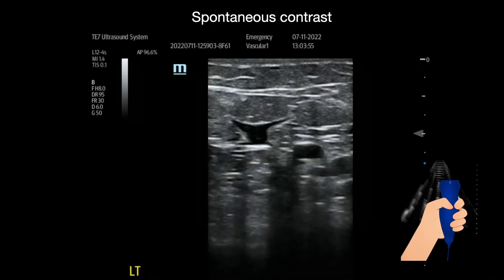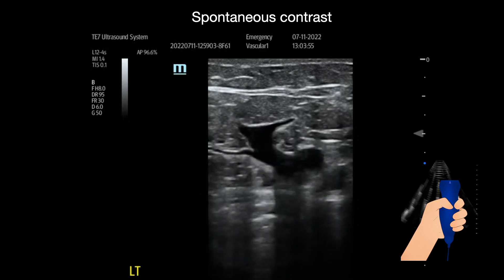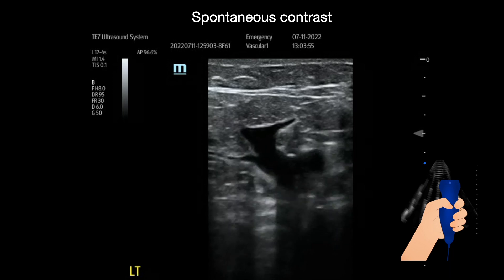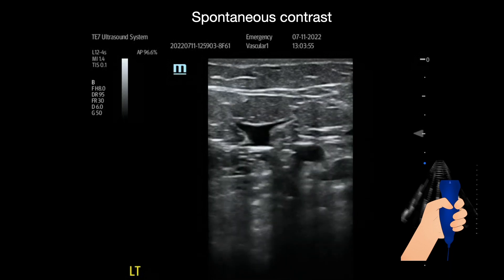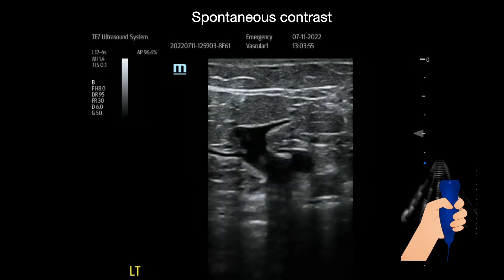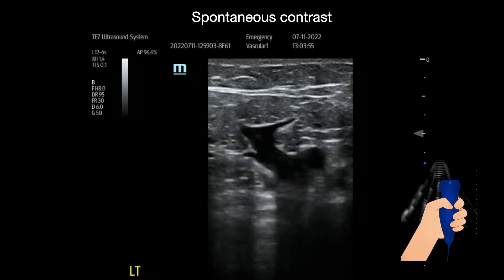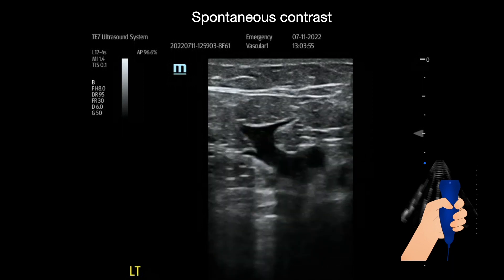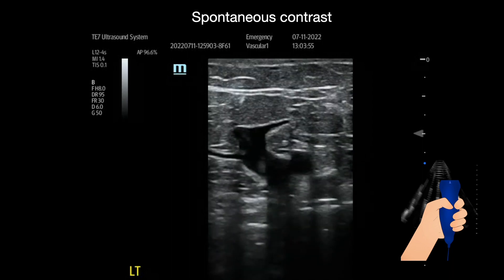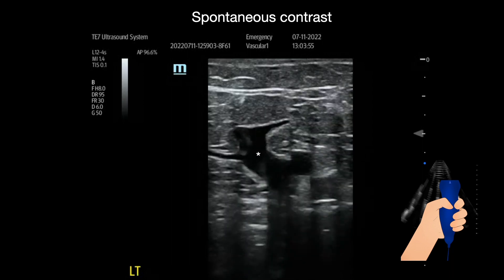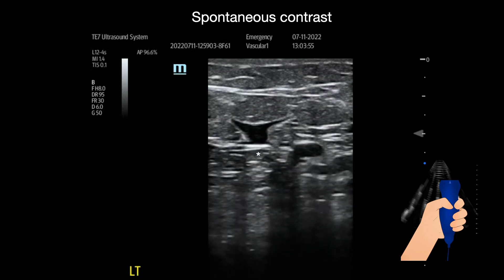Although spontaneous contrast is a phenomenon mainly described in the heart, you can find it anywhere where there is low blood flow, clumps of erythrocytes, and fibrinogen. In this case, we have the left saphenous vein with the femoral. Every time I compress the vein, you can see spontaneous contrast coming in and out of the screen right where this asterisk is.